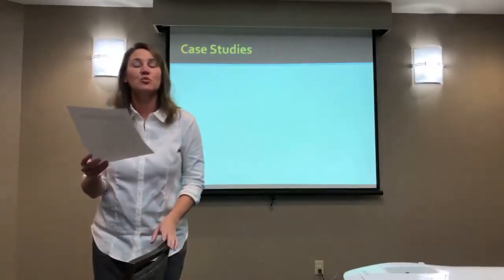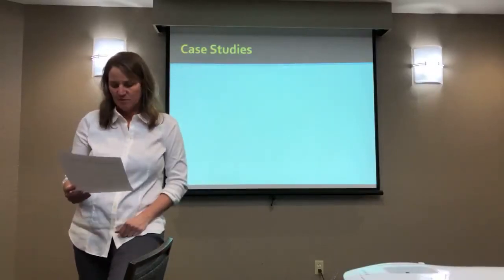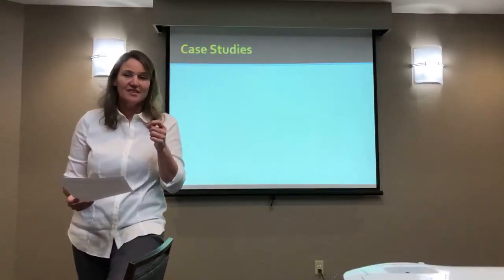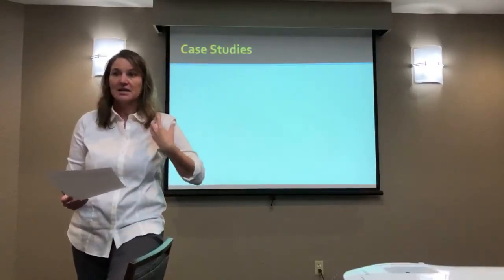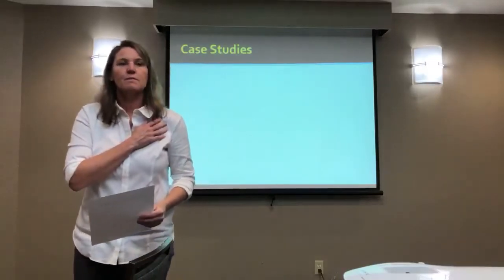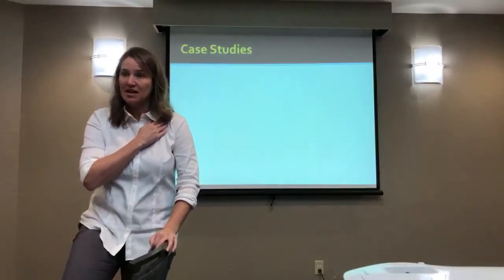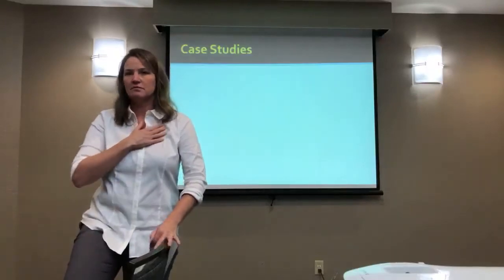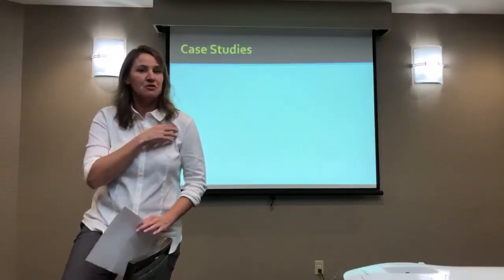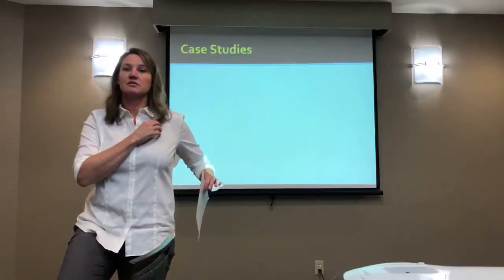But if you were going to, and your goal was to increase external rotation, what would your target tissue be? Well, it could be the capsule. The capsule. It could be tendon, ligament. Tendon. Exactly. You're going to have to assess the patient. So this is what I would recommend: you assess the patient, you identify what's tight. It could be that they have a forward tight pec minor, and if you identify pec minor tightness, could you ultrasound it and stretch it?